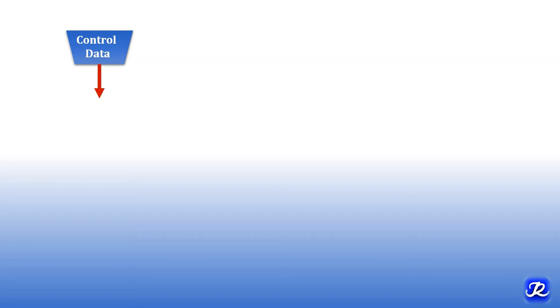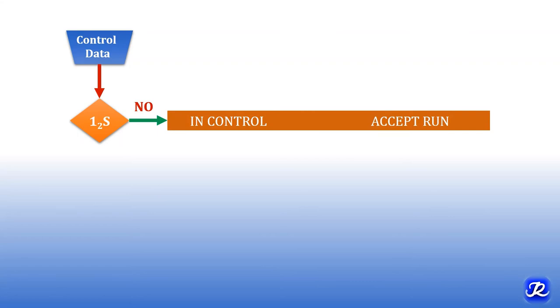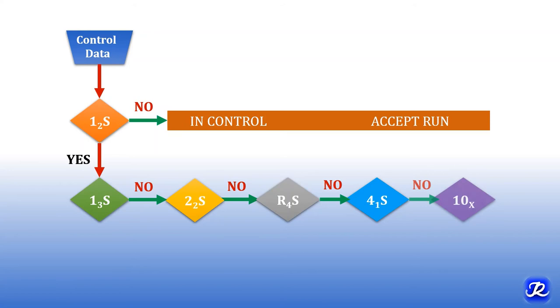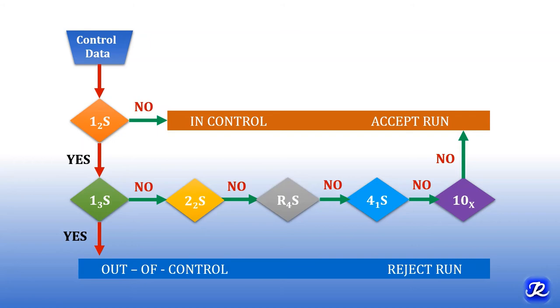Let's see when to accept or reject a run. Observe the control data: if the 1-2S rule is not violated, the run is in control — accept the run. If it is violated, it is only a warning rule; do not reject the run, but look for other errors. If the 1-3S, 2-2S, R4S, 4-1S, and 10X rules are violated, it is out of control — reject the run, look for errors, troubleshoot, and take corrective measures. These are all rejection rules.